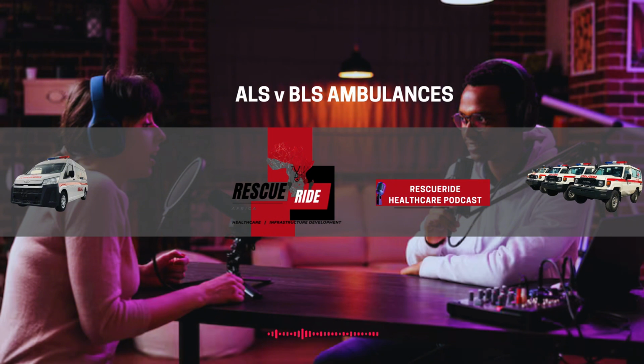So first, you've got your airway and ventilation equipment. Okay. This is critical for helping patients breathe. You're talking oxygen tanks, masks. Right. And it's not just one size fits all. You need different sizes for babies, children, and adults. Of course, makes sense. And then there are those bag valve masks, which are those things you see in medical dramas where someone squeezes a bag to help a patient breathe. Oh, yeah. BLS ambulances also have portable suction devices, which are used to clear obstructions from the airway.